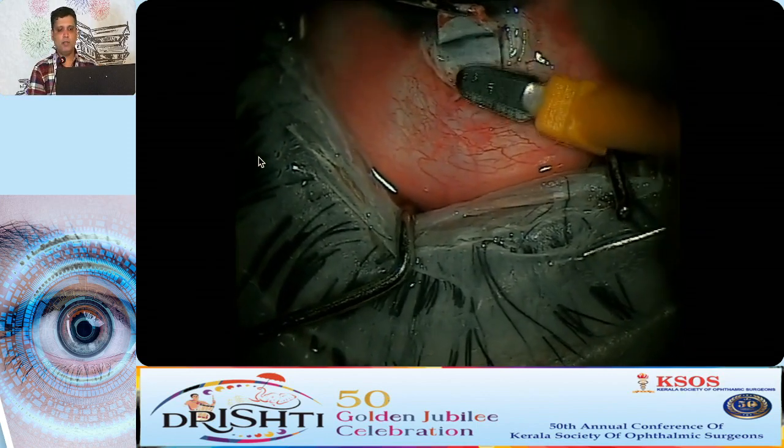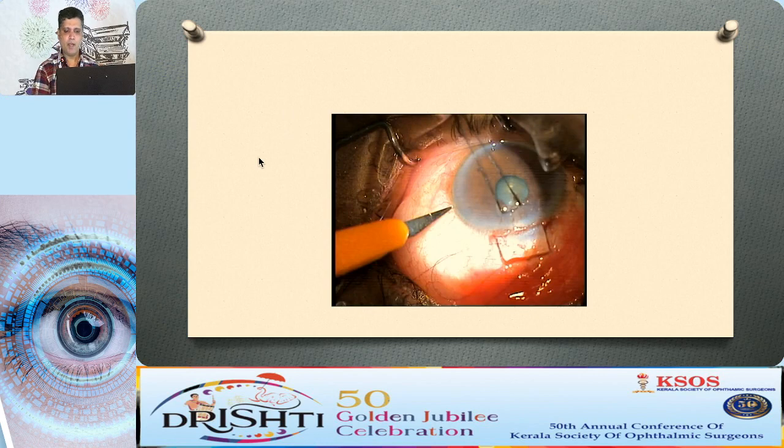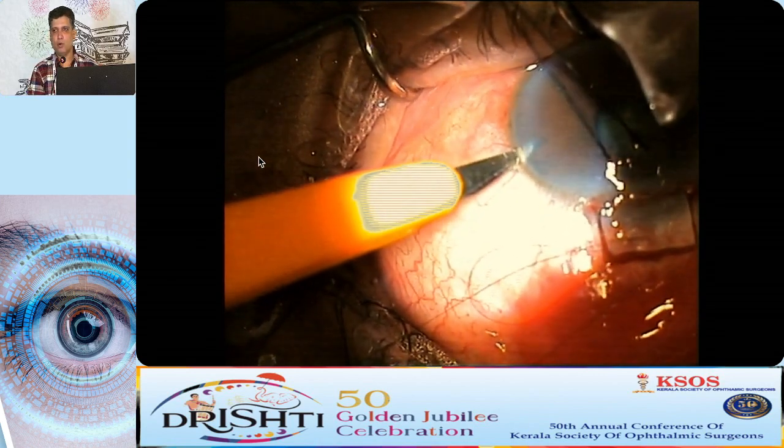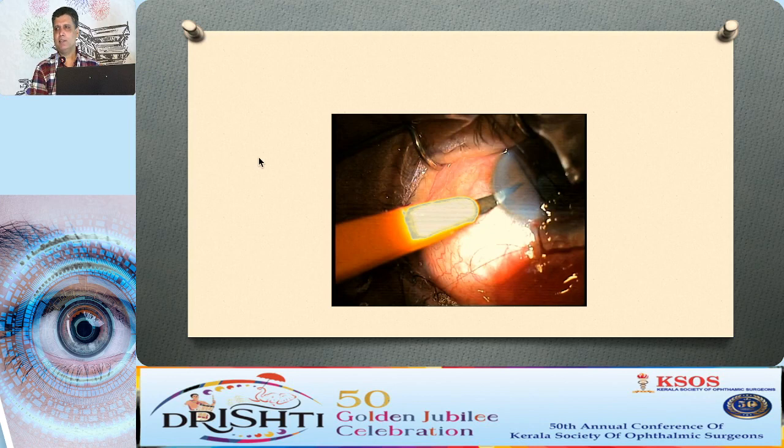And as you go on dissecting, make sure you dissect a little anterior to the blue-white line into the cornea slightly. And before making the scleral block dissection, I generally, in almost all cases, perform a very small, controlled, slow-entry paracentesis. Now, paracentesis is more important in cases like angle closure glaucomas or in cases where the pressures are very high, because a sudden decompression can result in choroidals, also in cases like Sturge-Weber, which are notorious for choroidal bleeds.